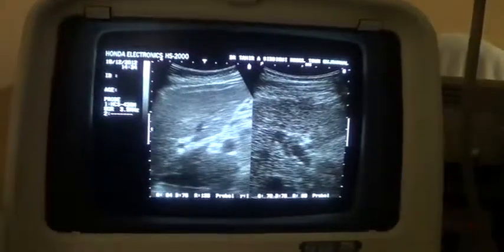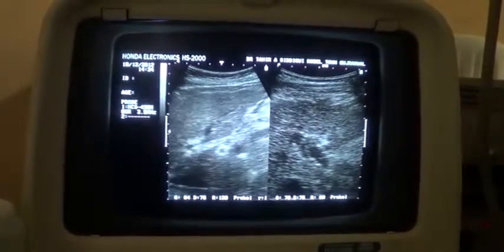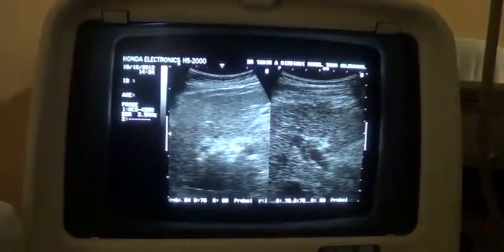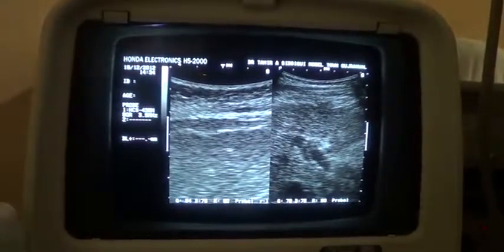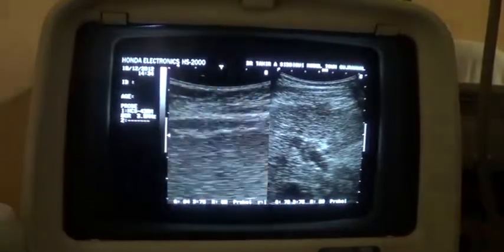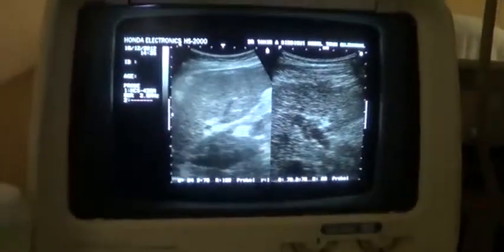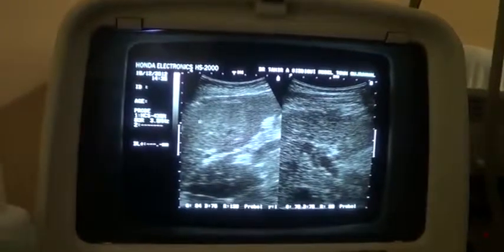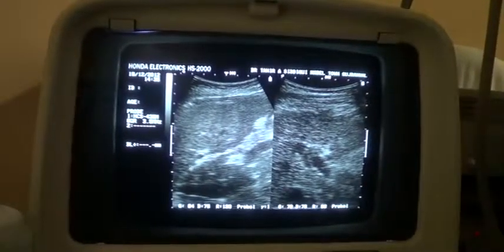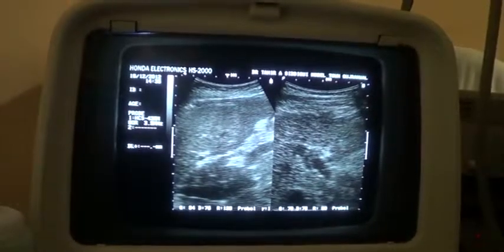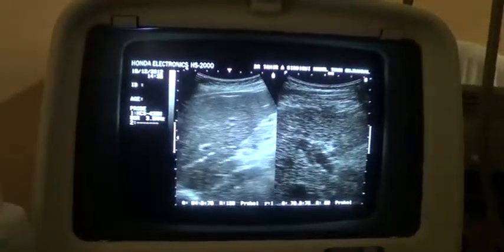On the right side of your image is another cirrhotic liver, but this is not an advanced stage. You can see the irregularity of the outer margin — this is the outer margin of the liver. See the coarseness and compare between the two segments in front of you. This is also a cirrhotic liver with coarse echogenicity. This is the ligamentum venosum, this is the caudate lobe. Compare this cirrhotic liver with that cirrhotic liver — both are cirrhotic and note the difference between the echogenicity and texture of both.